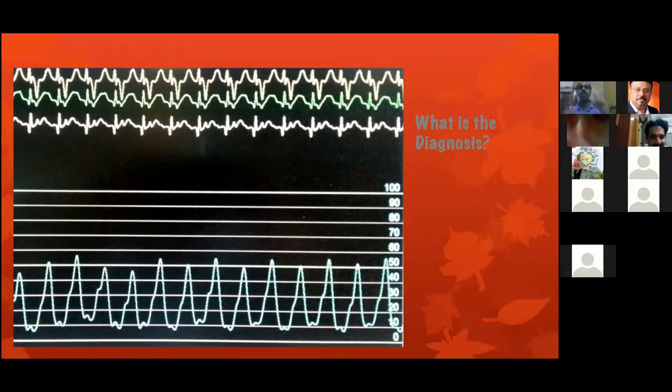Decompensation is due to right ventricular compliance being lost due to pulmonary arterial hypertension. If this patient has a secondary pathology of the AV valves, either tricuspid regurgitation due to progressive RV dilatation or mitral regurgitation due to mitral valve prolapse, both will lead to elevation of the V wave. Otherwise, A is equal to V in the compensated state, A more than V whenever there is pulmonary hypertension. So this is the standard pressure trace of an ASD.